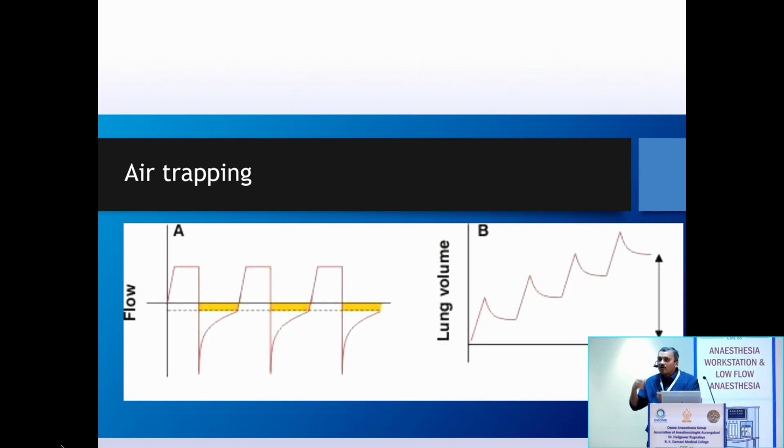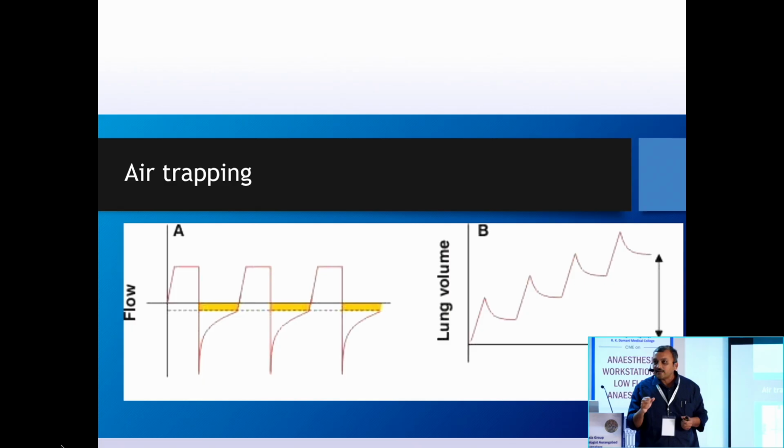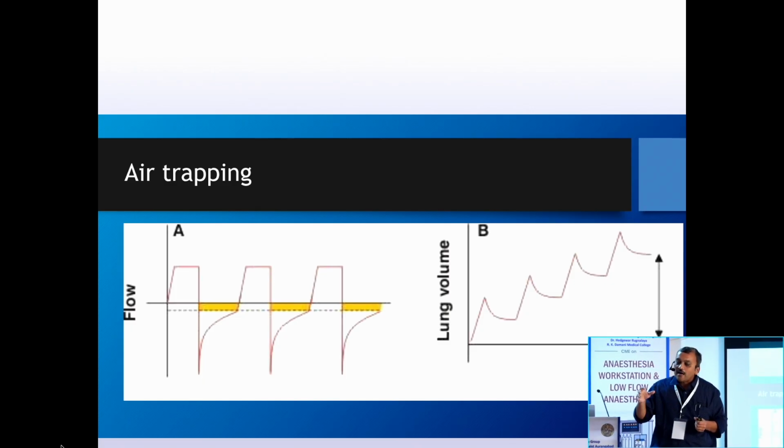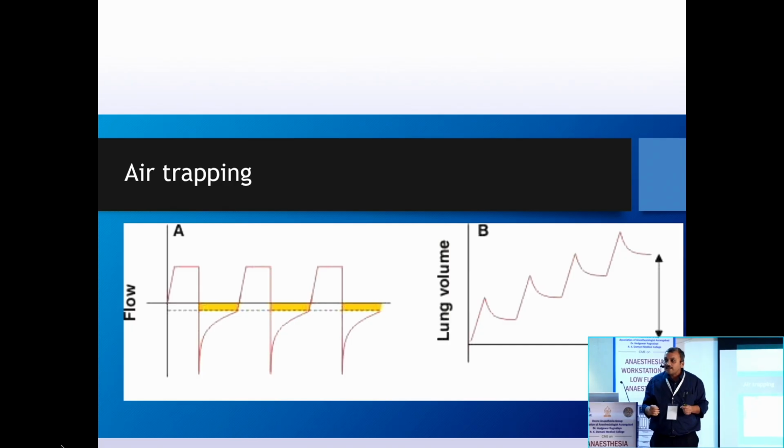See, you have been called in the emergency department, acute asthma ka patient hai, intubate karna hai. You intubated the patient. Aapne intubate kiya, 2-4 minute ke baad mein you suddenly notice the patient had got into cardiac arrest. One of the reasons might be you are ventilating it like a normal patient, 10 to 12 ka breaths you are keeping, the air was just being pumped inside, nothing was going out, it is like a tension pneumothorax. One of the easiest ways, disconnect the tube, you will see a lot of gush of air coming out. You need to understand the treatment.